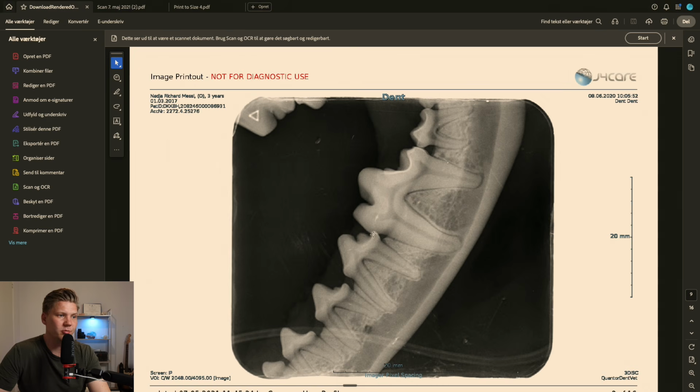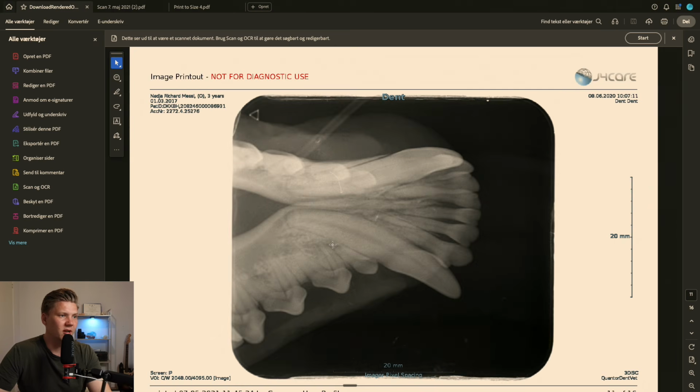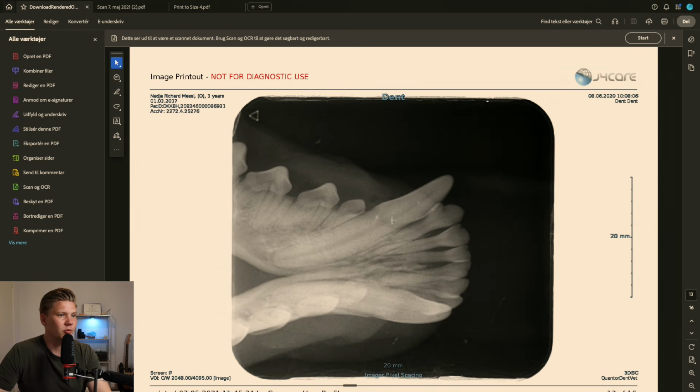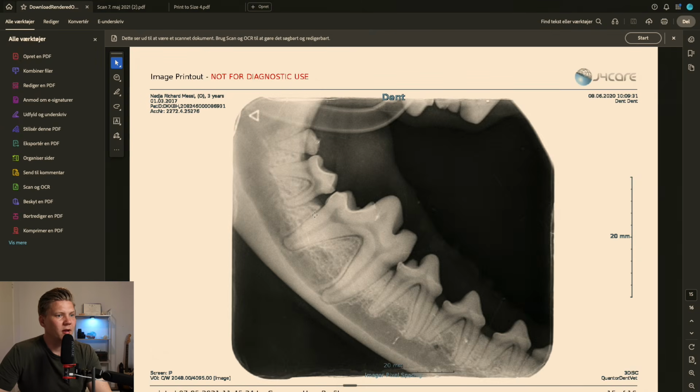There's nice bone up to the crowns here, so that's good. Also this picture, this was a canine picture, looks quite nice. Another canine picture, it was turned upside down, looks nice. Incisors, I don't see a lot of bone loss here, looks okay. Also maybe some bone loss right here in between the teeth. And these are the premolars. These look okay. And so you can see the bone height here looks all right.